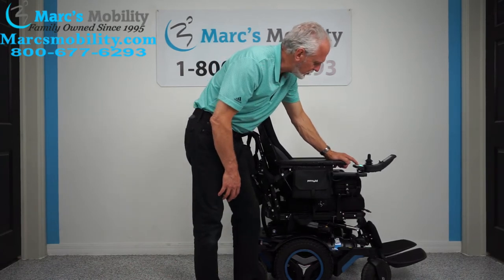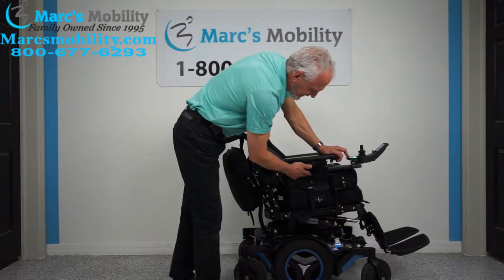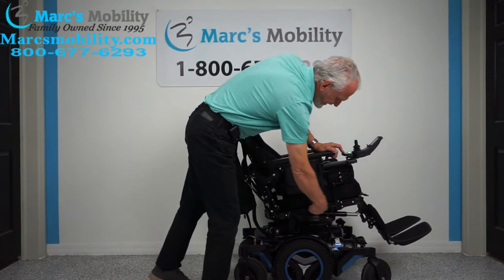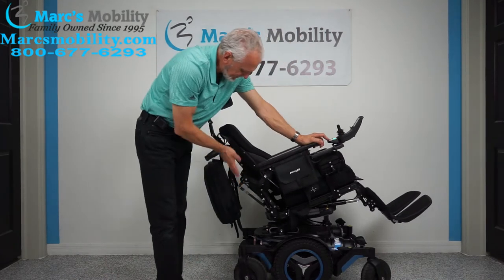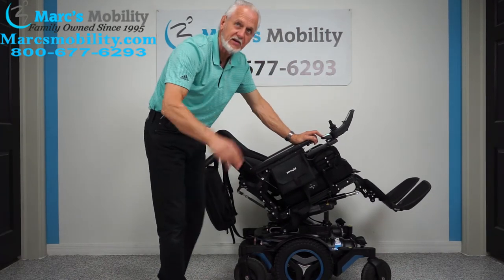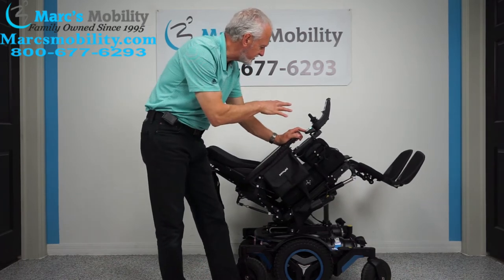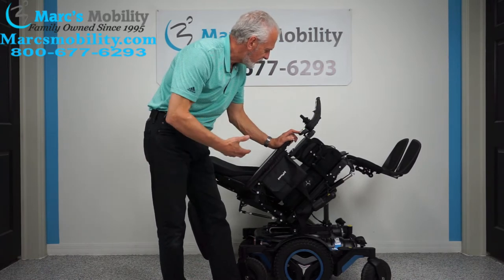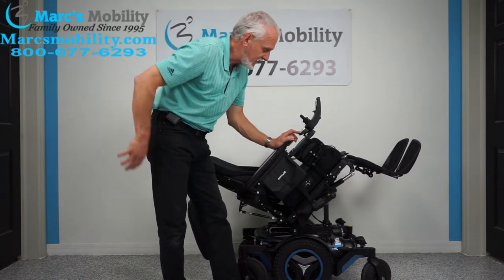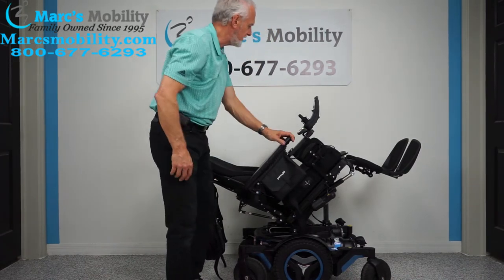The next feature is called the electric tilt. The electric tilt is when the base goes back — and when the base goes back, it takes the legs and the back with it because they're all connected together. This position is good if you want to take pressure off your body, improve circulation, or take pressure off your lower back, because all your weight will be sitting back rather than on your rear on the seat.